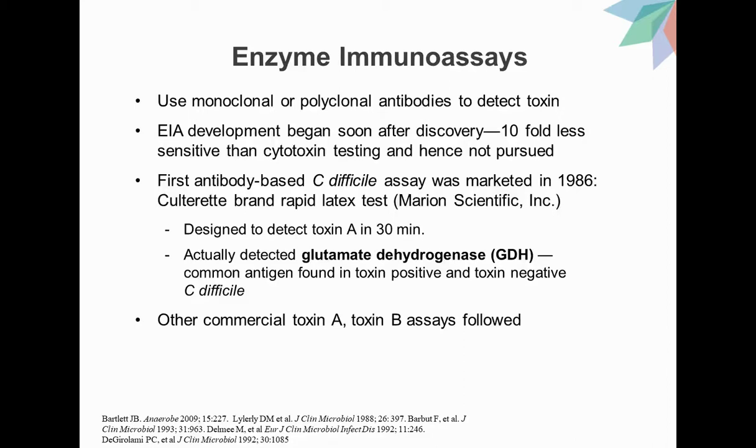Interestingly, enzyme immunoassay development began soon after the discovery of C. difficile and its toxins, but it was observed to be tenfold less sensitive than cytotoxin testing, and hence was not pursued at the time as a viable option for diagnosis.